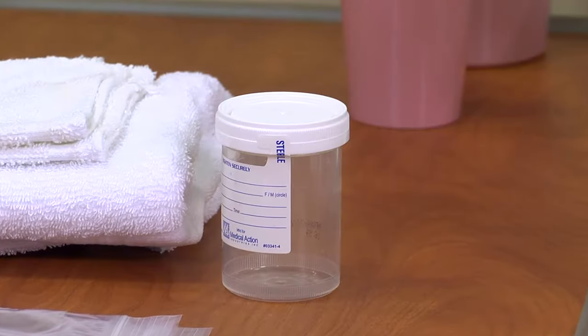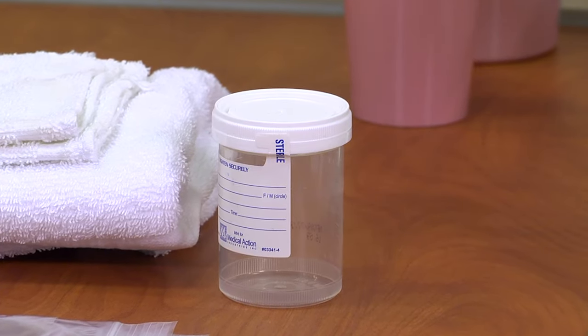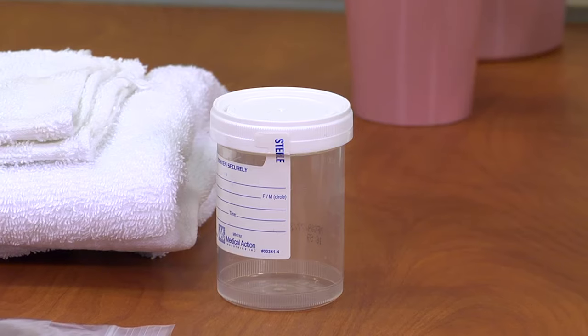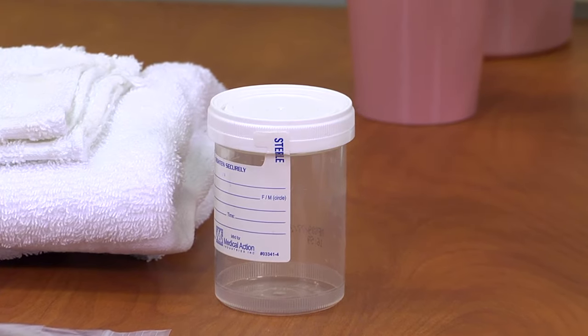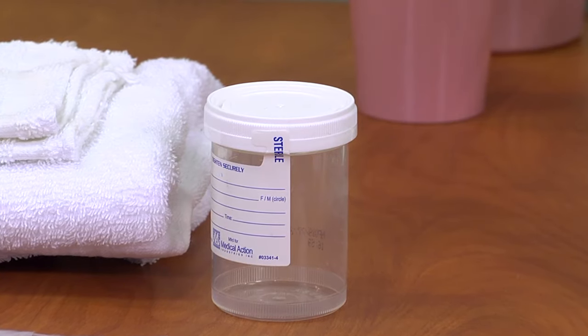Open the sterile specimen jar, maintaining the sterility of the inside of the container. Set the cap down with the inside, which is sterile, facing up. Take care not to touch the inside of the cap or the container.